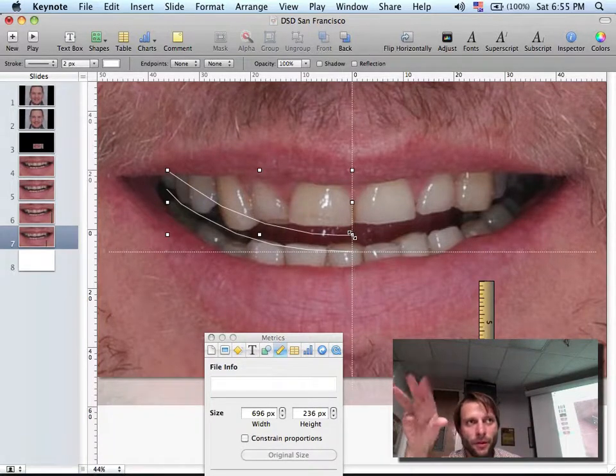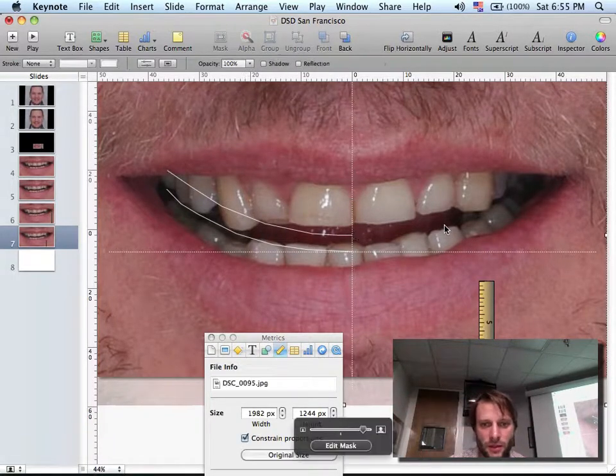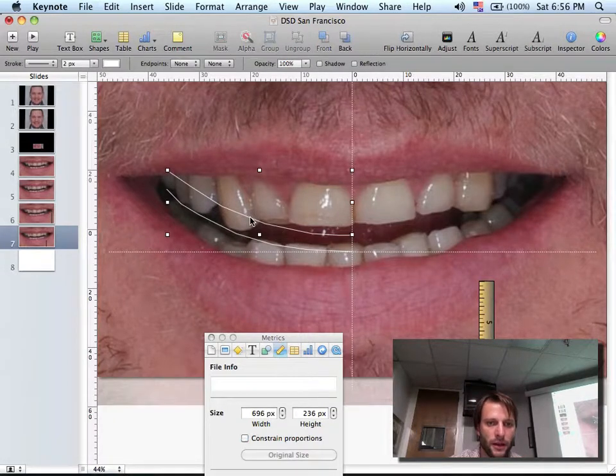Don't worry about a perfect drawing at the first time, because once you have this drawing, you can click twice on the line and reactivate the dots and change the dots by dragging the dots or moving on the arrows on the keyboard. My suggestion, move the dots on the arrows so you can go little by little and improve the drawing little by little.